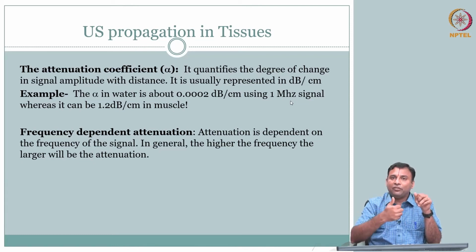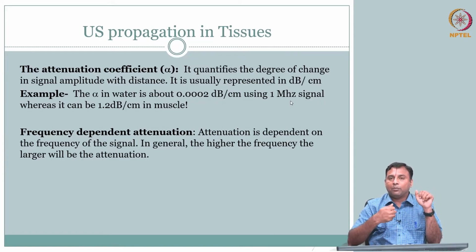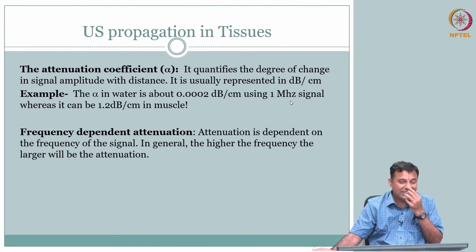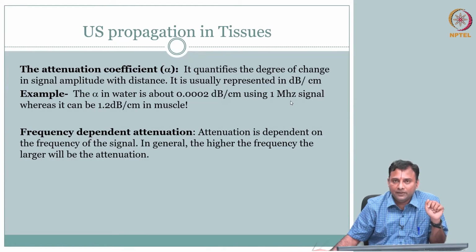But if I increase my frequency, the depth through which the signal will go is going to be reduced, or attenuation is going to come into the picture. So the signal that you can capture and measure is going to become less and less with depth. Okay, so this is an inherent trade-off in ultrasound that you will face. Higher the frequency, lower is what we call the penetration depth.